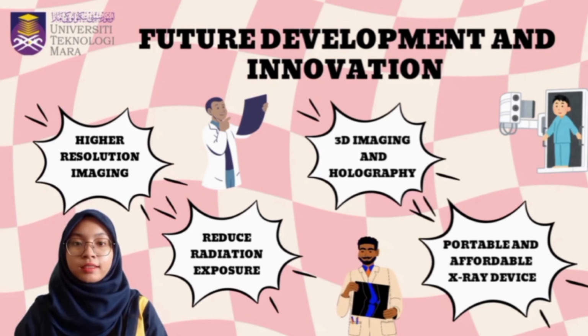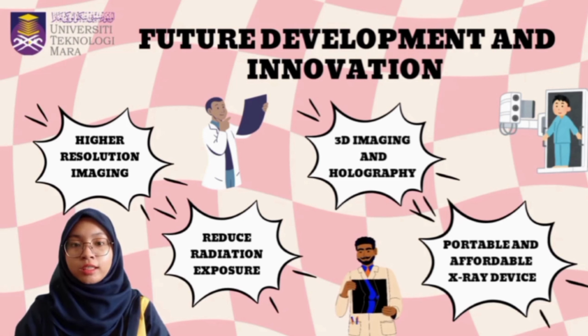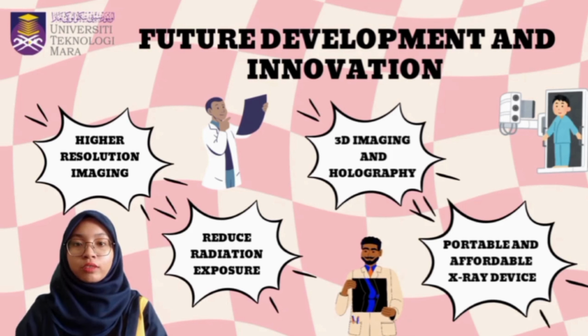The primary focus is reducing patient radiation exposure during X-ray procedures. Improvements in detector technology and image processing algorithms are anticipated to create more efficient systems that need less radiation to produce high-quality images. Third, 3D imaging and holography. These technologies could offer three-dimensional views of internal structure without requiring invasive procedures, providing a more comprehensive diagnostic tool.